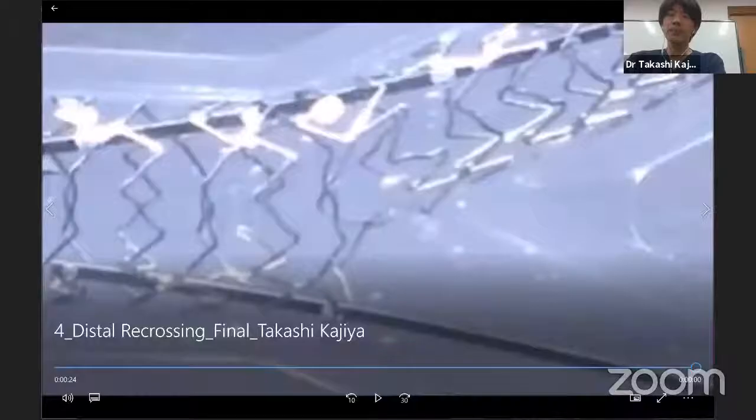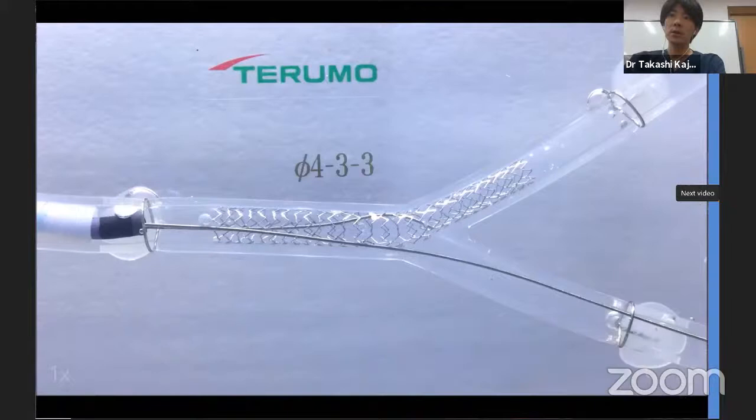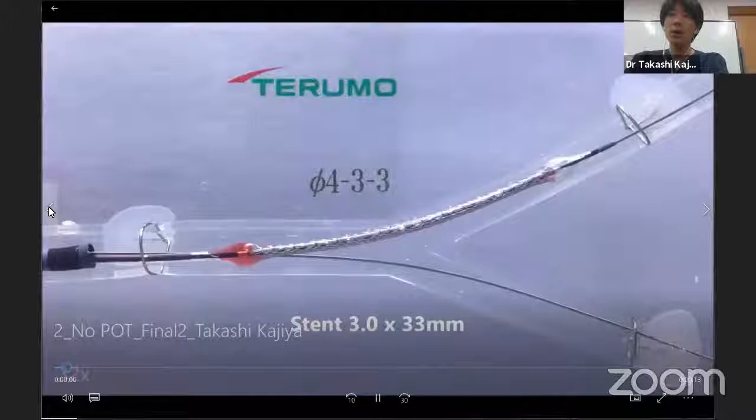Thanks for that, Dr. Takashi. Do you have any comments on those demonstrations in the wet lab as well? Okay, so in this demo, I want to emphasize just 2 points. 1 point is POT, already discussed. POT doesn't mean just a proximal dilatation. Proximal optimization technique. For the POT, the distal marker of your balloon should point at the carina. And you have to choose an appropriate size of POT balloon. Then you can cross your guide wire easily. This image is distal rewiring.